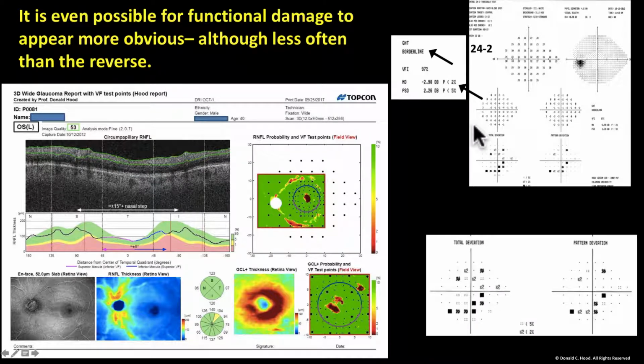All right, let's blow this up. I'd say this is a pretty clear defect here. Same with here, by the way. But let's take a look at this one first. That corresponds to this. So this very subtle stuff here, which you could almost dismiss as an artifact perhaps, but this very subtle stuff here is clearly abnormal.